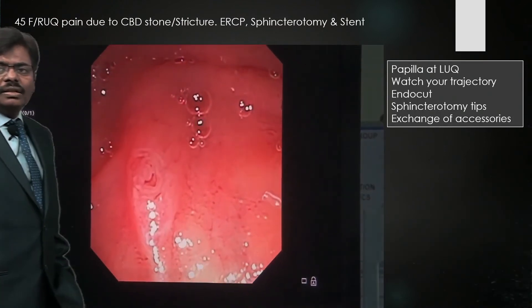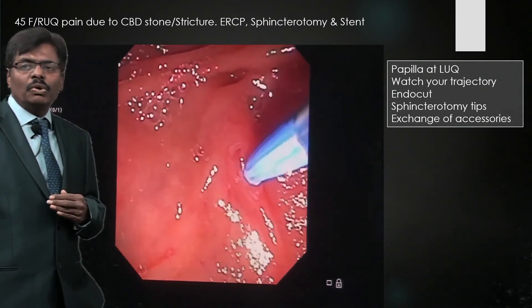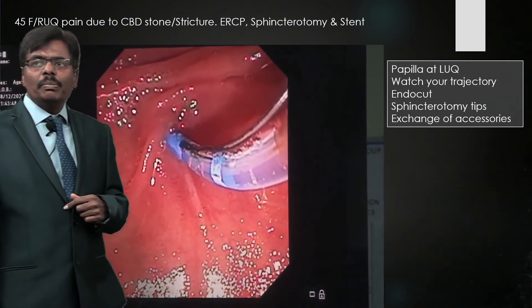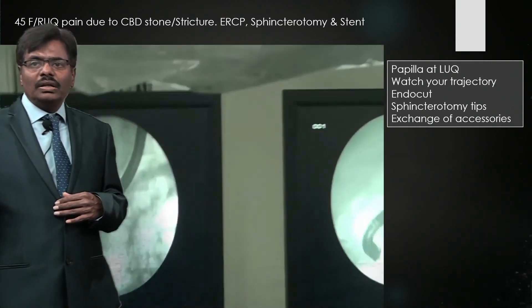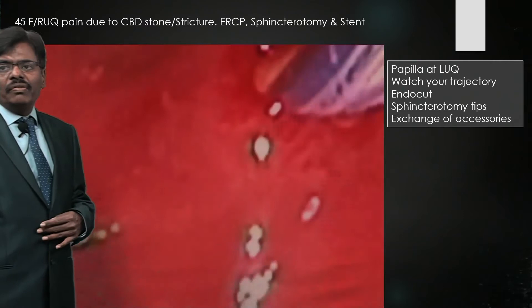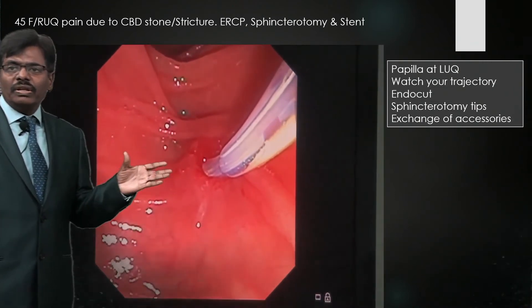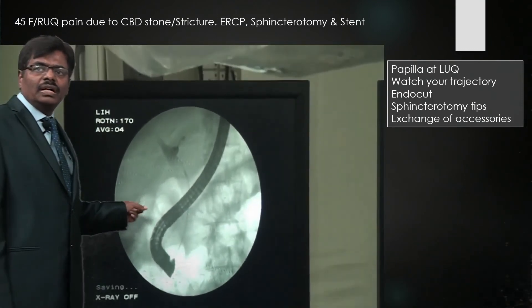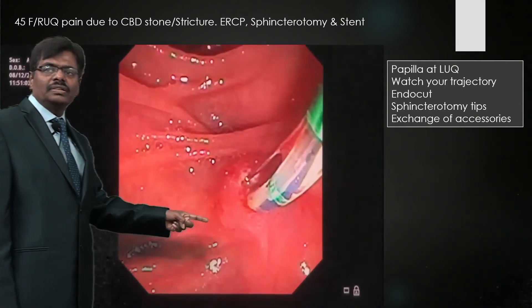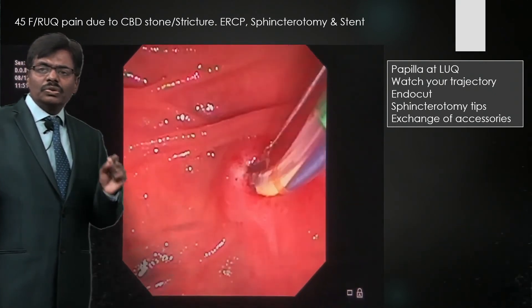Here for example, the ampulla is slightly low — I slowly maneuver until it is more at the center or left upper quadrant, then the trajectory is ideal. Watch my guide wire on the monitor — here it is nicely positioned. In this unedited video, the anesthetist is moving the camera between the endoscopy view and the C-arm, sorry for that. We have cannulated, injected contrast, and you can see the guidewire inside with a dilated duct visible on fluoroscopy.